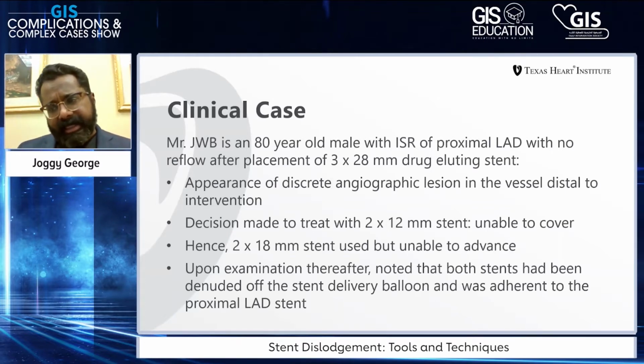And at that time, with this difficulty, they examined the stent delivery balloons, and it was noted that neither stent delivery balloon had the stent crimped on it. So this, of course, was very concerning to the operators.